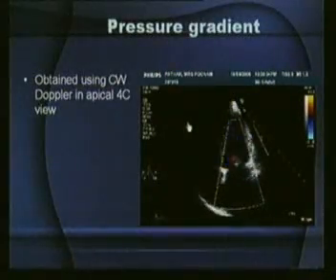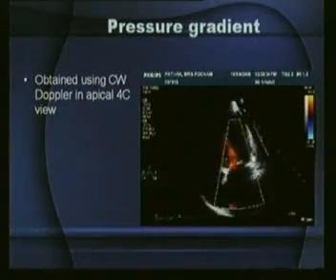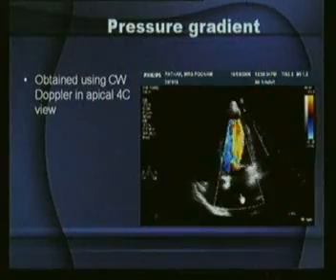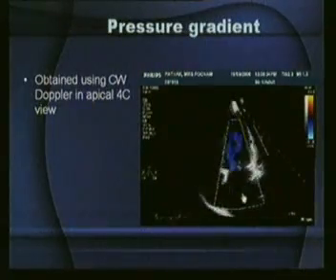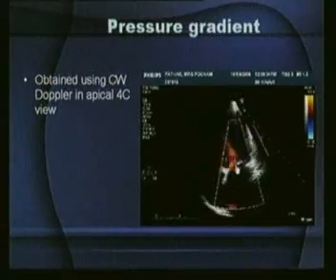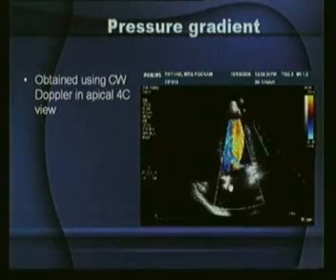From the parasternal long axis view, you have gone straight to the four-chamber view. And what do you see here? Left atrium. That's the left ventricle here, very clearly. And I'll show you the color phenomena taking place here. Below the left ventricle is the left atrium. And you have taken the dimension. It is an enlarged left atrium. As the blood is entering from the LA to the LV, you find a jet, and I'll explain about this. But at least you are seeing no jets in systole back into the LA. So at least you are clear that you are dealing with predominantly mitral stenosis. And of course, we'll take this in several other views.